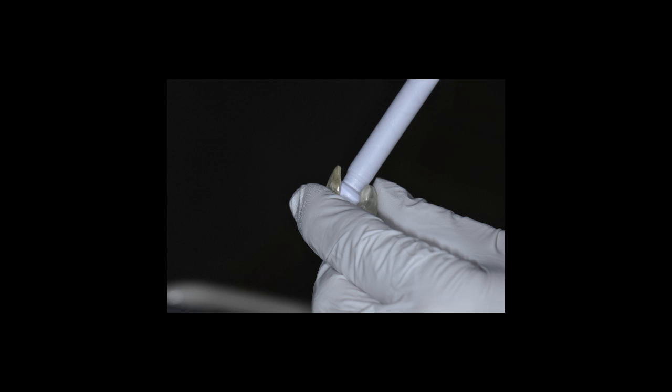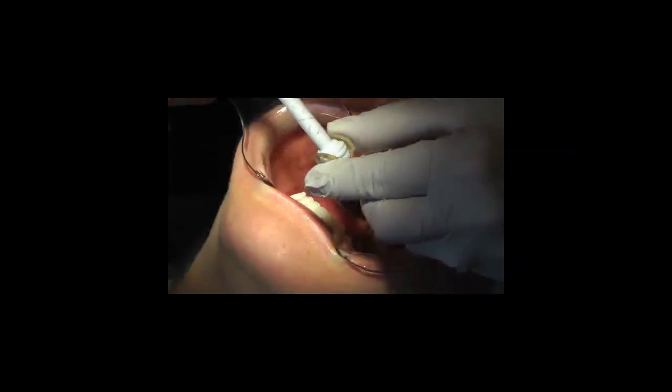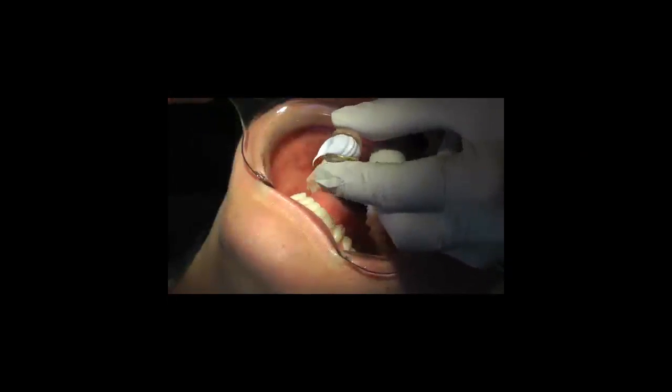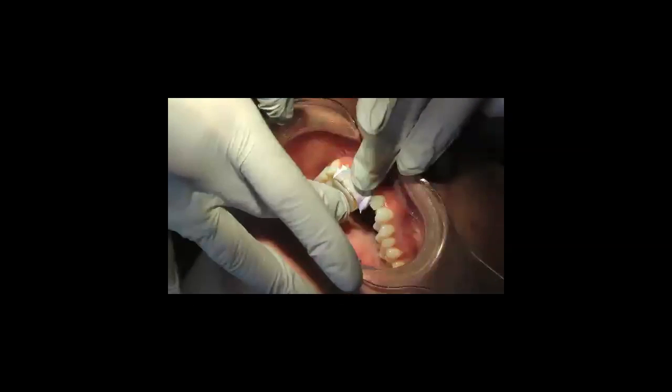Next is using bite registration paste to customize or reline the inside of the plastic platform. You want to fill the plastic platform or Lucia jig but not overfill it, as we don't want excess material. I'm going to seat it over the centrals but not all the way to the incisal edges.